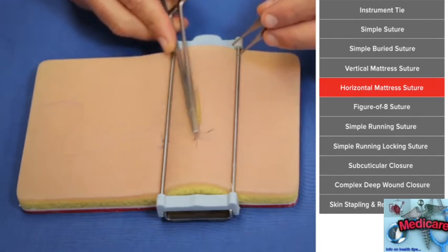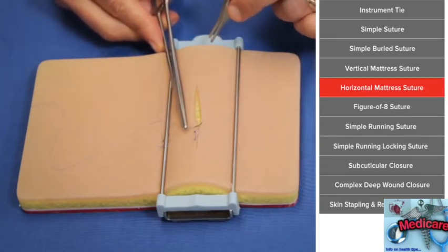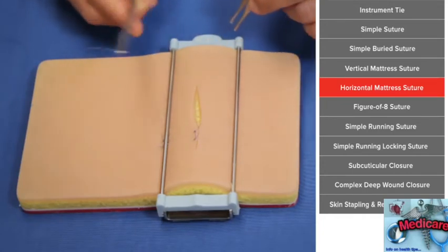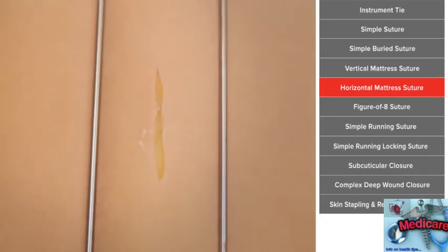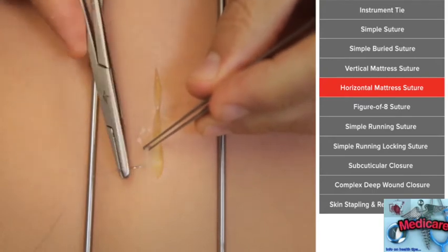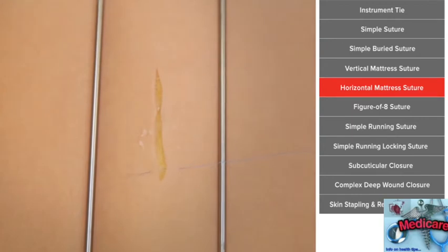Now we're going to do a horizontal mattress. Here, the idea is not to go near, near, or far, far. Take the same size bite each time. But what you're going to do is, it's effectively two simple sutures in one suture. So what you'll do is you'll enter the skin now as if you would for a simple suture. And instead of tying this as a simple suture, turn your needle around, move the same distance you would for your simple suture, and enter it the same way, almost like you're doing a simple suture on the other side.